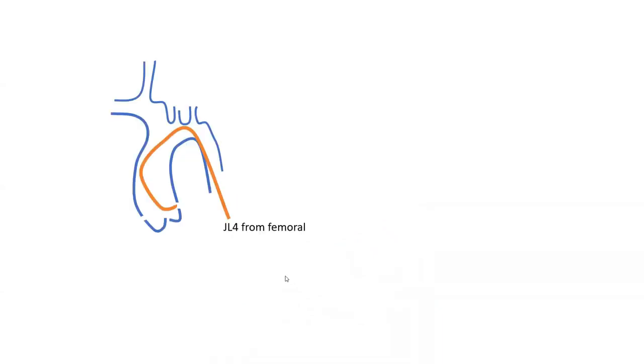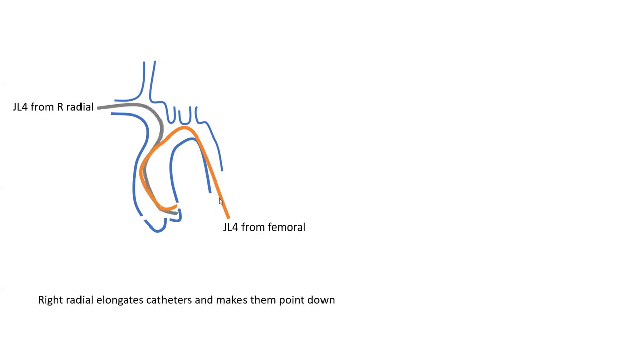Starting with the first clinical tip: this is a Jutkins left four coming from the left femoral and engaging the left coronary. It's very easy to engage the left coronary from a femoral axis using the Jutkins system, which is the preferred system for that. Now take that same Jutkins left four and use it from right radial, and here you see the first difference between radial and femoral.